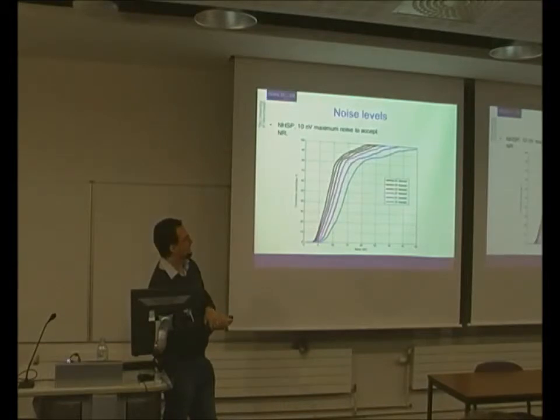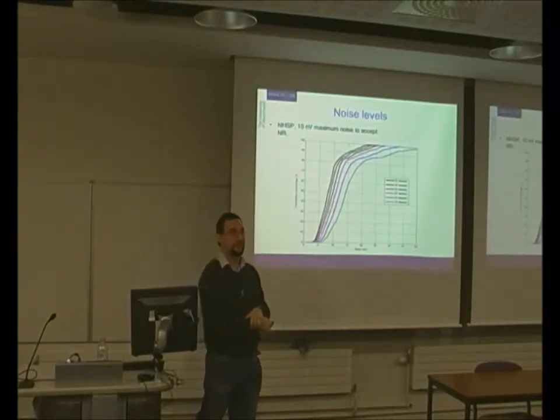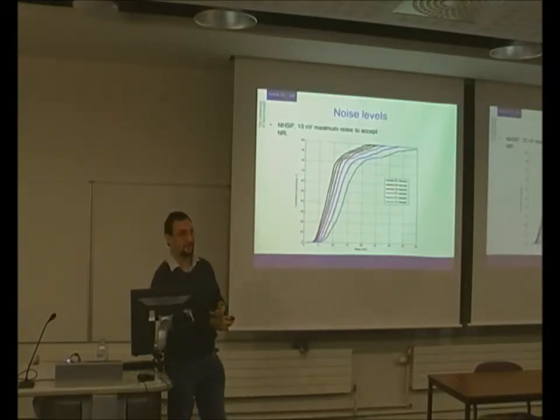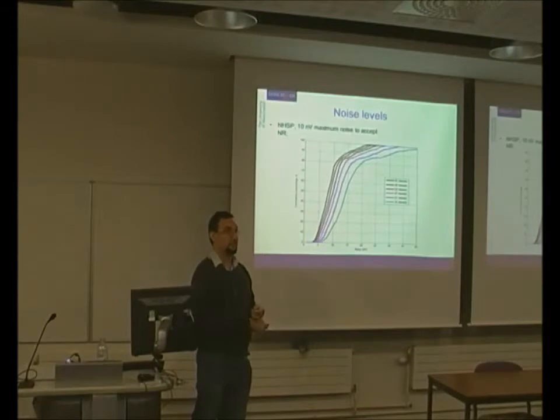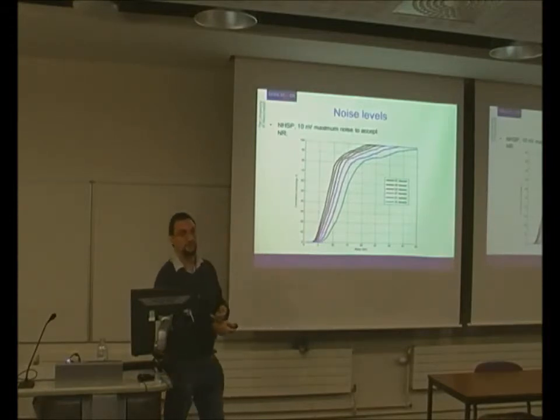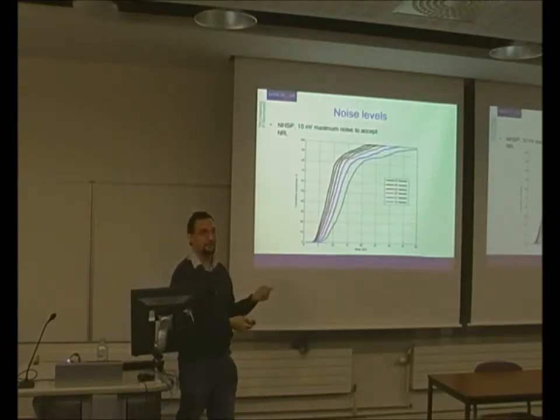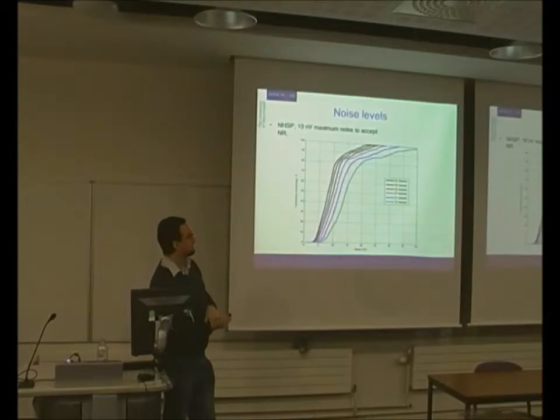And if we use the same protocol for the babies of only 15 sweeps, 4 minutes of recording time, less than 20% of our recordings would be considered as being a conclusive result, and 80% would be inconclusive. So clearly, these protocols for babies can't really be applied to adults, because the recording conditions are different. There's more noise. The adults don't tend to fall into a deep sleep necessarily, or at least they didn't in our studies, and no studies I've ever run has had that happening.